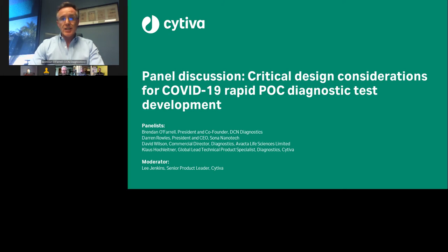So, as a result, the detection of antibody alone for acute phase diagnosis isn't really viable, and the topic of whether a total antibody test is the ideal specification rather than one that differentiates IgG and IgM is being pretty hotly debated in places. But while antibodies might not be appropriate for acute phase diagnosis, they still show a lot of valuable applications in the context of COVID-19. So potentially the most valuable use of wide-scale antibody testing is as a public health tool, indicating levels of exposure to the virus. There's lots of talk about using these assays to indicate immune status, but the science is still largely out on whether that's a valuable use case for a lot of these tests.